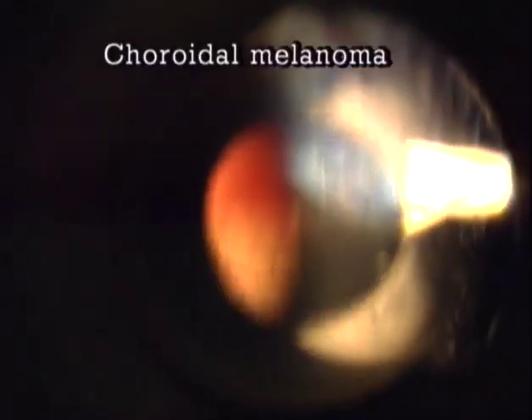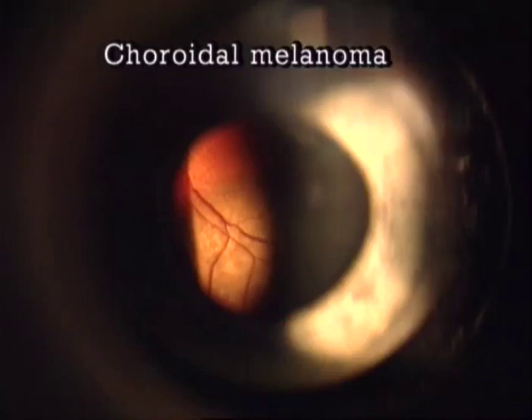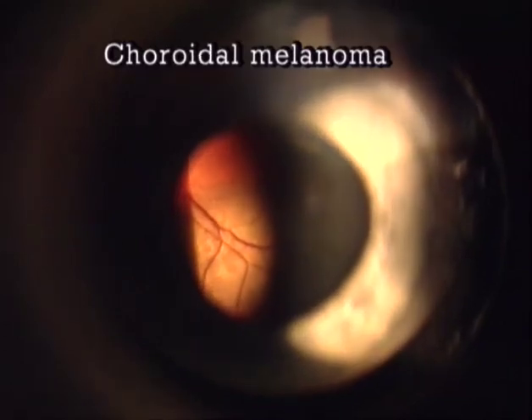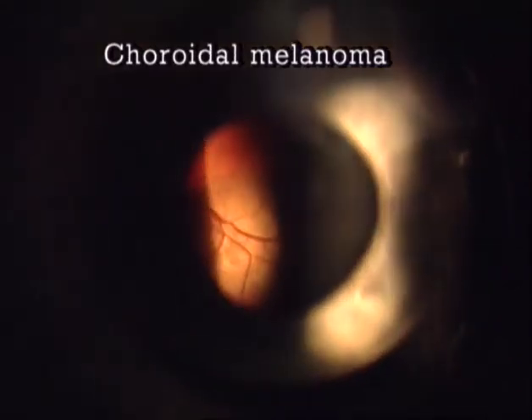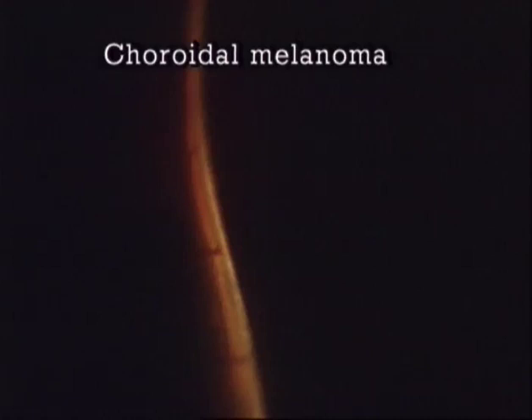As is shown here by the example of a choroidal melanoma, the optical knife is especially valuable to prove an elevation when evaluating a tumor. At first glance, the lesion appears rather flat. In optical section, the elevation of the tumor becomes apparent. And at higher magnification, the narrow slit light shows the contour of the overlying retina, the surface of the tumor, and a thin layer of fluid between them, proving the existence of a flat retinal detachment.